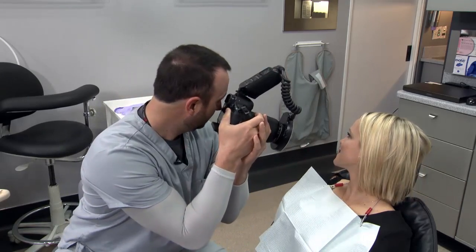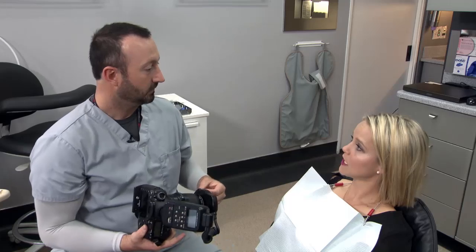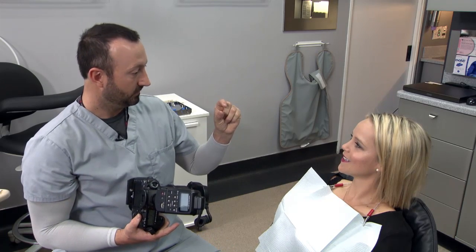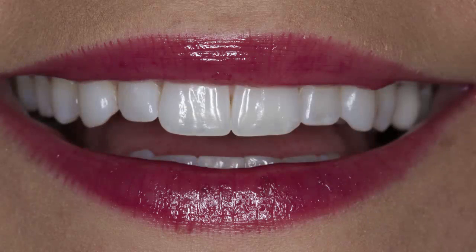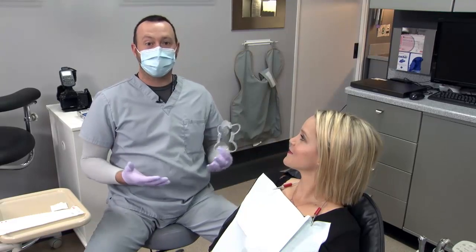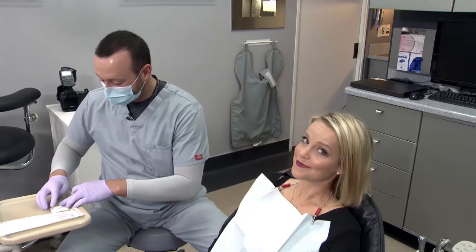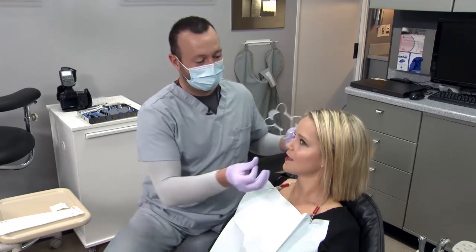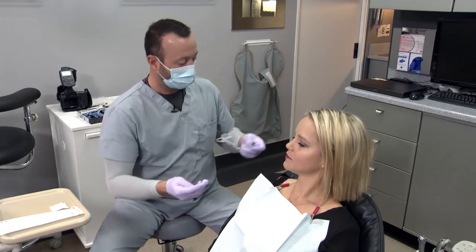The next shot I like to do — just to be able to see the incisal edges of all the teeth — I have the patient open about two or three millimeters so the maxillary teeth are not covering up the mandible. Normally I would ask my patients to remove their lipstick before the procedure, but in this case a little bit of Vaseline right on the lips ensures the retractor doesn't cause any cracks in the lips.